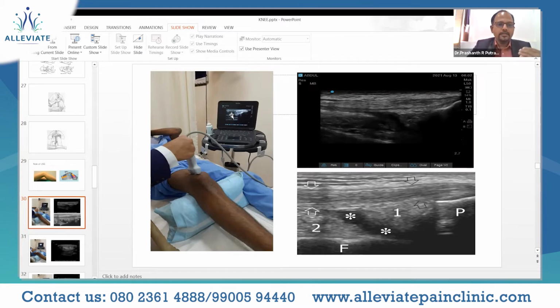So normally, as we saw in the previous presentation, there were numerous bursae. In a normal setting, the bursae are not visible. Only if there is a fluid collection, extra fluid in that bursa, does it become visible under the scan. So normally it is not visible, but we should have a very thorough knowledge of the anatomy of where the bursae are located so that we can pick up the abnormalities.